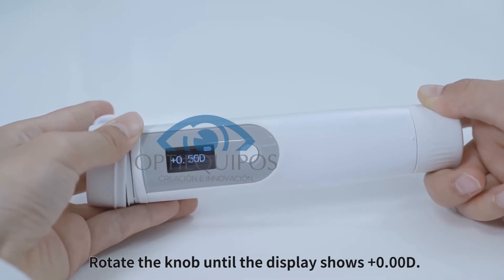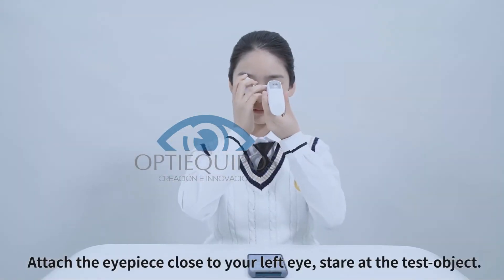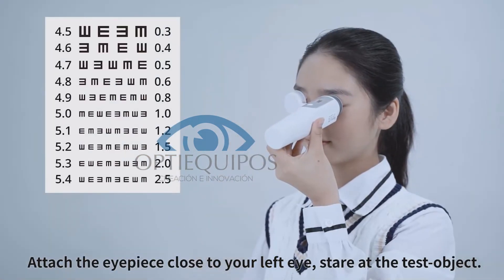Rotate the knob until the display shows plus 0D. Attach the eyepiece close to your left eye and stare at the test object.